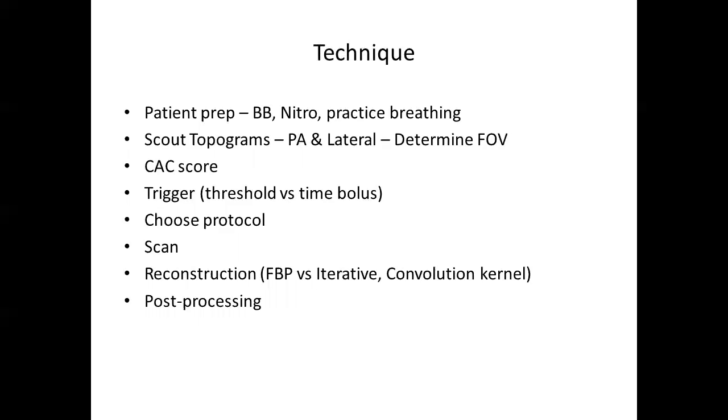Okay, so we sort of touched on that. So you've got your patient prep, you've given them the medicines, the tech will practice the breathing with them so they don't Valsalva. And then you'll do your scout topogram, so you'll do a PA and lateral, and based on that, you decide your field of view, just to get the heart. And then we'll do a calcium score.